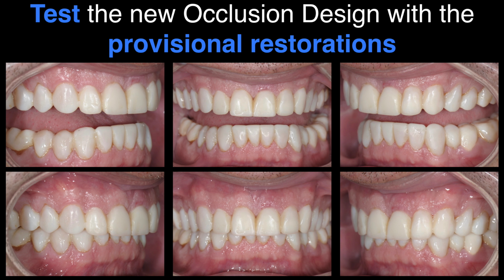Case two, I went direct to ProTemp Plus provisionals. Again, I'm very comfortable with that material, used to using it. I used Luxatemp a little bit too. On some cases, we don't have the shade we want in ProTemp Plus, although they've recently added another bleach shade, so that should help us. But I'm comfortable carving these. I use the XT discs, and you make a shell from the duplicate model of the wax up that I use to create in-mouth provisionals that I remove, carve, and cement in with various different cements that we decide to use depending on the needs of the case.